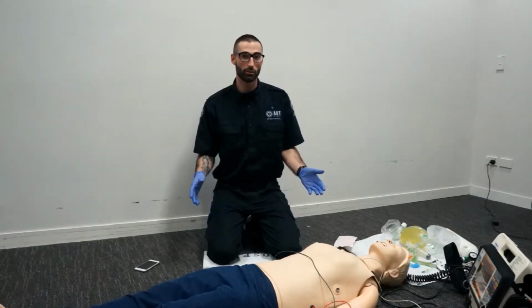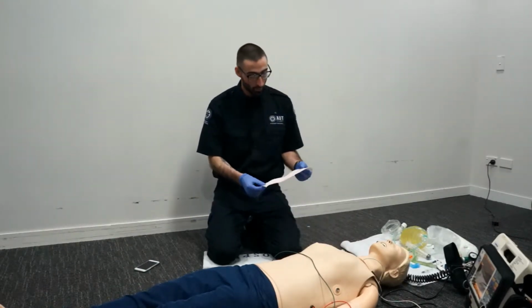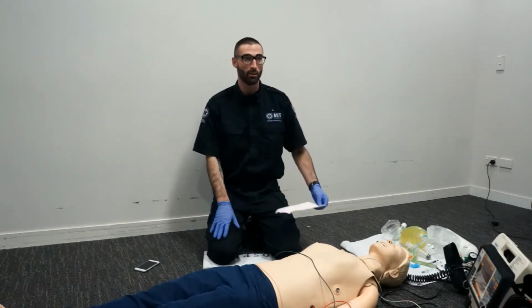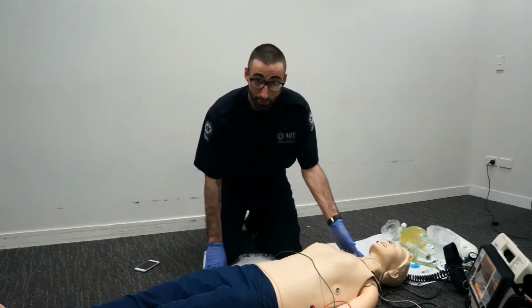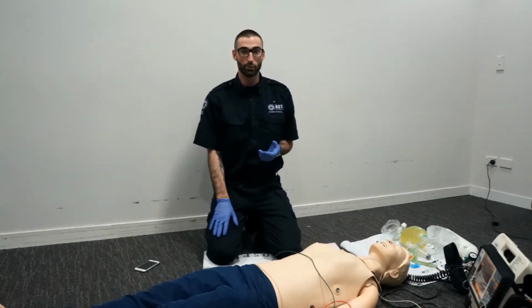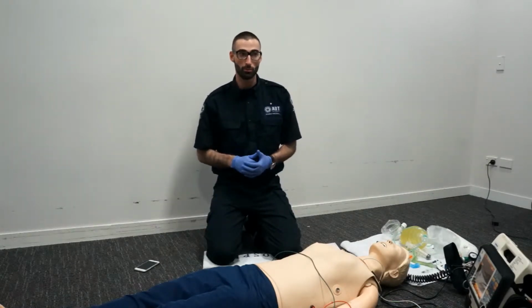So with Steve now on the ground, we've attached our 12 lead and we've got a rhythm strip. On here it appears that we have a wide complex tachycardia at approximately 160 beats per minute. When we feel for a pulse, we note that we do have a carotid pulse, but we don't have a radial pulse. It is important to consider differentials for VT so that we can rule out SVT with aberrancy, either due to a bundle branch block or Wolff-Parkinson-White syndrome.